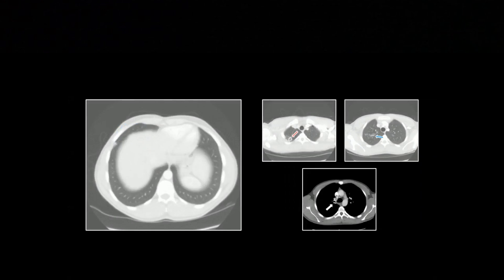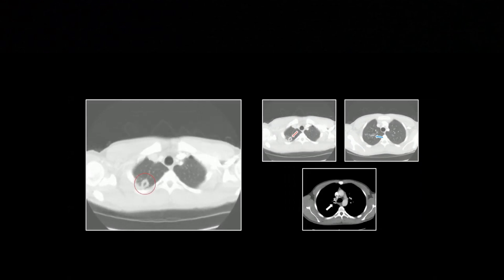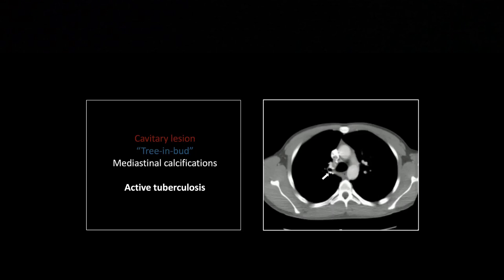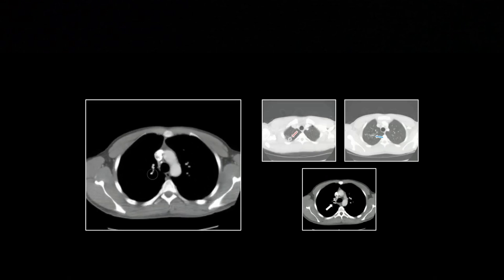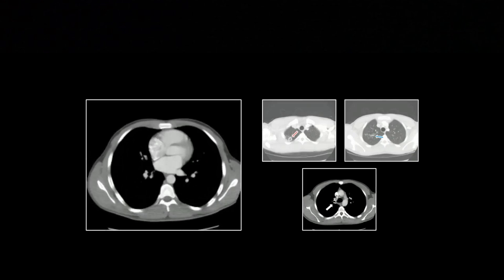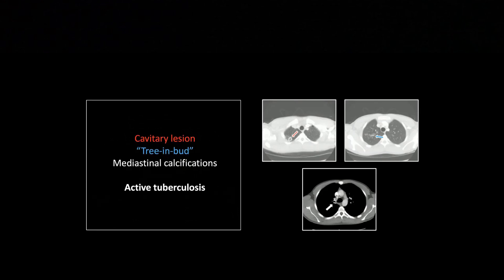A little more tree-in-bud in the right middle lobe. A very helpful thing is to find calcifications in the mediastinum, which really suggests tuberculosis. Coming from Arizona, we saw tons of coccidioidomycosis, and coccidioidomycosis does not cause calcified lymph nodes. So if you see a cavity with tree-in-bud, it could be TB or cocci — go look at the mediastinum. If there are calcifications, TB is the far better choice. There are mediastinal and hilar calcifications here that tip you to tuberculosis.